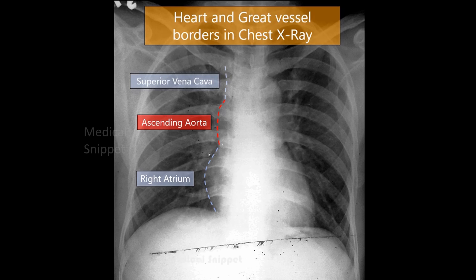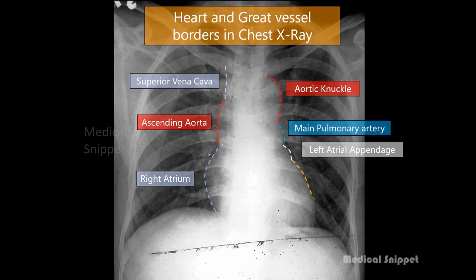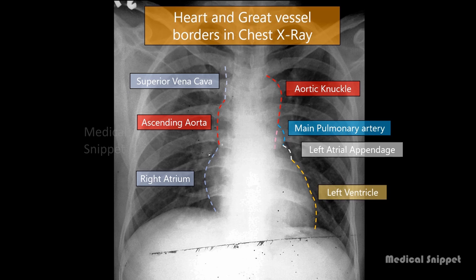The left border of the cardiomediastinal silhouette, from top to bottom, is formed by the aortic knuckle, the main pulmonary artery, the left atrial appendage, and the left ventricle. One can also see the outline of the descending thoracic aorta.